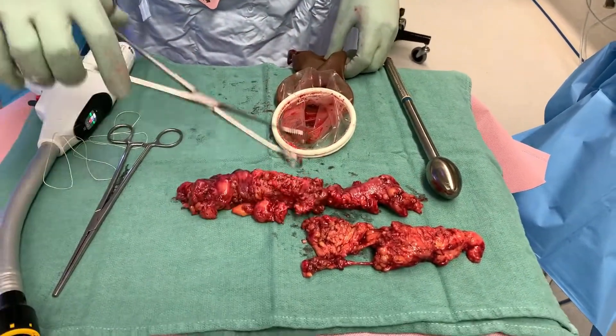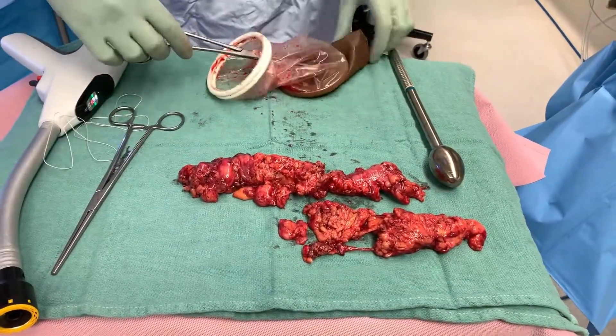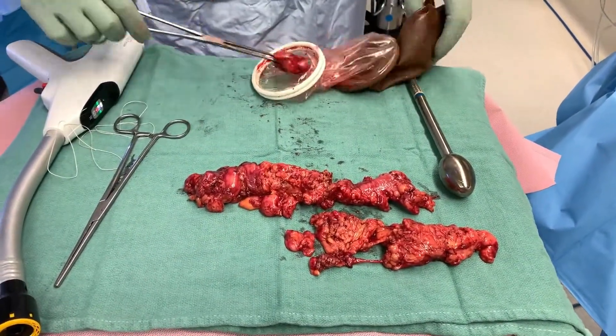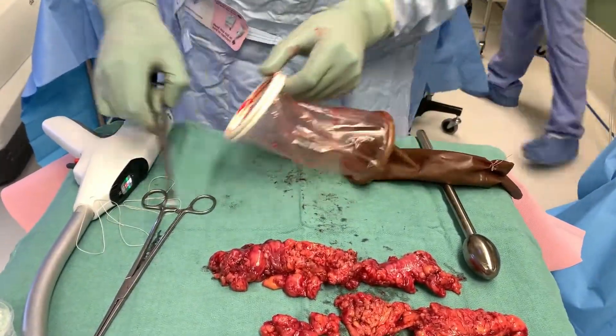Here we're digging into the glove to take out the portions of the specimen. That was the mesentery; this is the colon. We have two or three other pieces to take out, making sure nothing is left inside the abdomen. There's the specimen, and there is the glove technique.